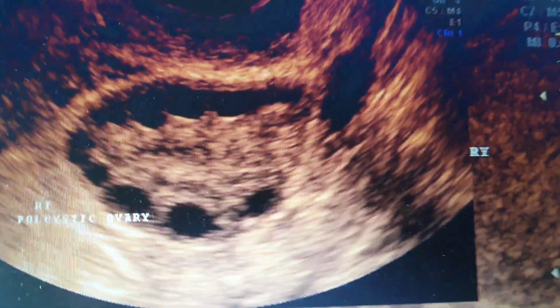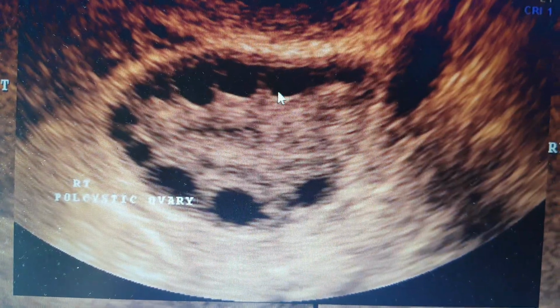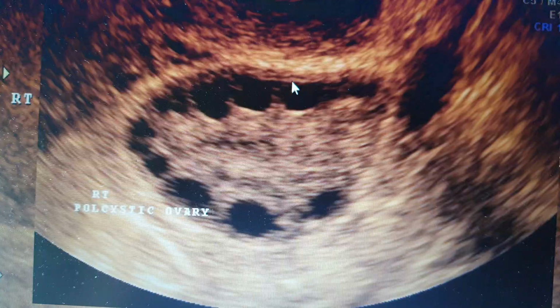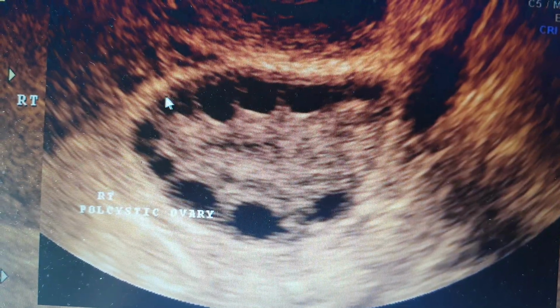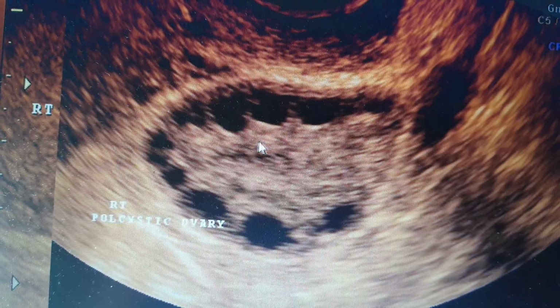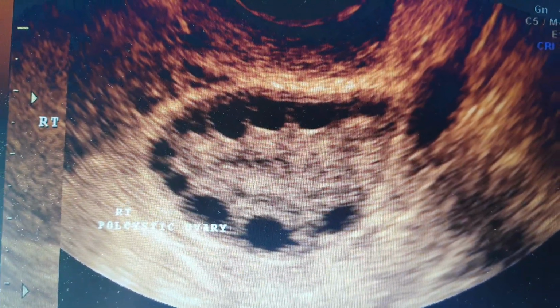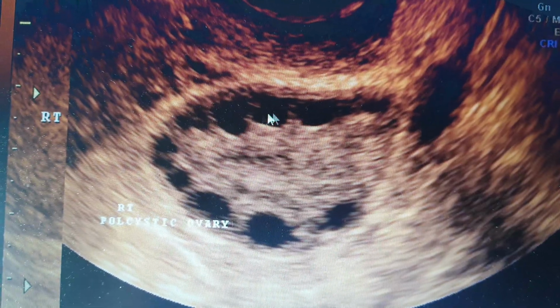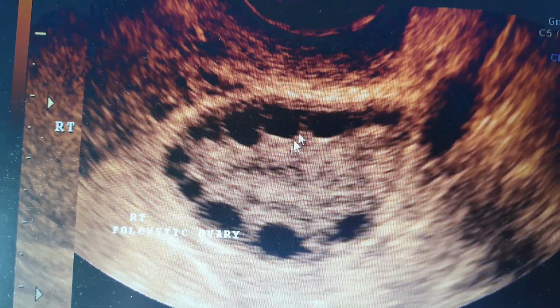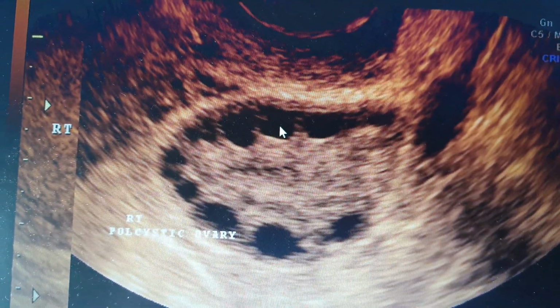And the polycystic ovary gives that texture, as you can see here: multiple subcapsular atretic follicles arranged around a hyperechoic stroma. Multiple subcapsular because all of them are not extruded outside the ovary. Of course, they did not enlarge and they did not reach the size of dominant follicles to be extruded or to erupt from the ovary, and that's why they are just arranged here around that hyperechoic stroma, and they are subcapsular and they are atretic, not exceeding 8 to 10 millimeters.